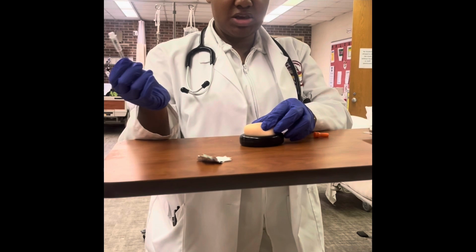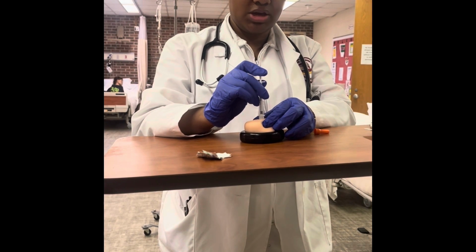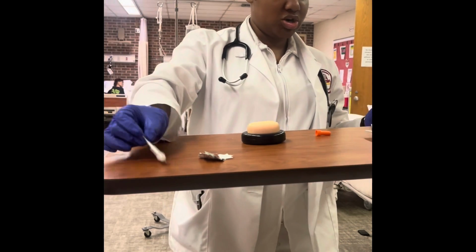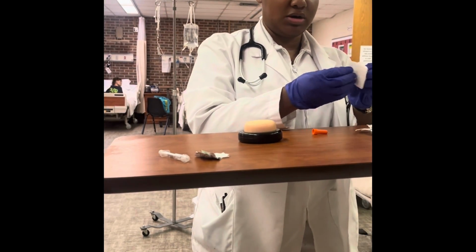I'm going to pinch the skin. All right, we're going to feel a little poke, Mr. Smith. Inject the medication slowly. Oh, this is so full, I don't even go in. I'm not going to go in. Throw this in a sharps container, and then I can apply pressure to the injection site with some gauze.